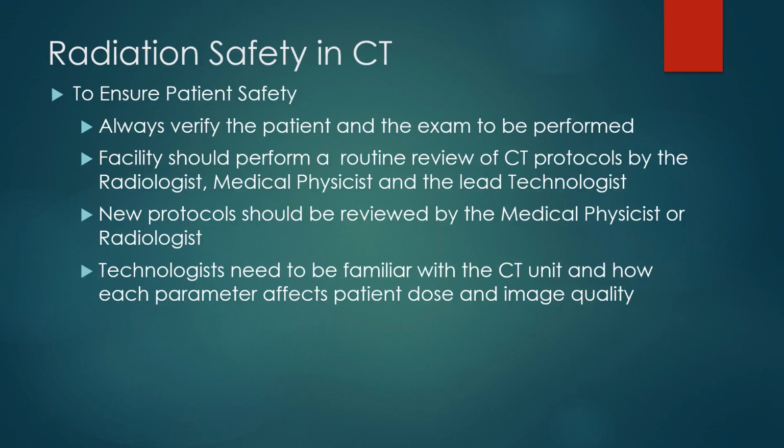To ensure patient radiation safety, always verify the patient and the exam to be performed. A routine review of the CT protocol should be performed by the radiologist, the medical physicist, and the technologist at regular intervals. New protocols should be reviewed by the medical physicist or the radiologist prior to scanning patients. Technologists need to be familiar with the CT unit and how each scanner parameter affects patient dose and image quality.